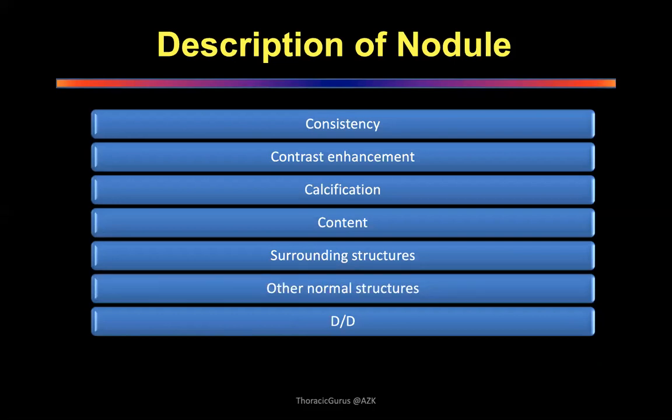Now, you do not need to go through all of this. You may have all of this, or you may have some of this, but at least some should figure in your description. Do you understand that? So really, a CT scan is more than 90% of the times an icebreaker. When you go into the Vivas and I put up a CT scan, I put it up to give you an opportunity to talk. And this is the best investigation to get in the exam.